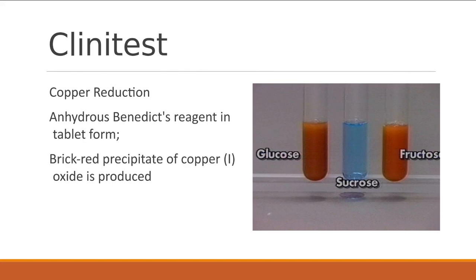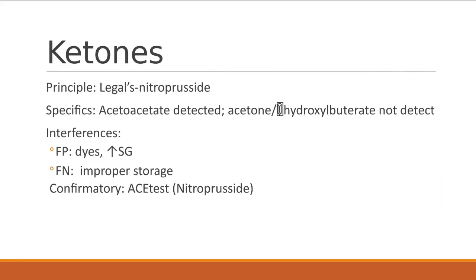Remember, I said they've gotten rid of a lot of the confirmatory tests because these are done in early testing on newborns. Newborns are tested for several different things when they're first born. You've got the little cards, and you have blood tests that they can do with their heel stick. Because they do this testing now for galactose to make sure whether or not the kid has this, you don't really have to do Clinitest testing anymore. It's something that's going away. But it was significant for inborn error of metabolism.